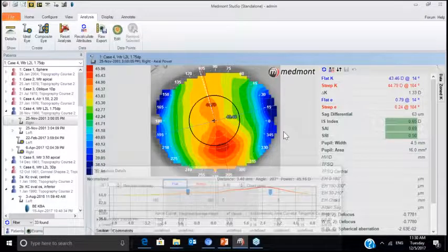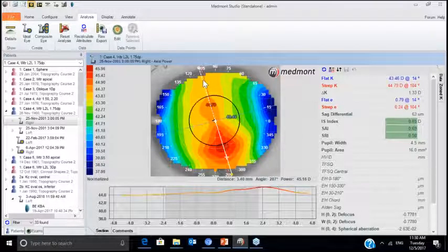And literally every single contact lens that you will ever fit is based on constructing the lens with the proper sagittal depth for the sagittal depth of the eye. If the sagittal depth of the contact lens is inappropriate for the depth of the eye, then our lens is not going to fit properly. It's going to be either too steep or too flat. So if we can measure the sag of the cornea, then we can have an understanding of the sag of the contact lens we need.